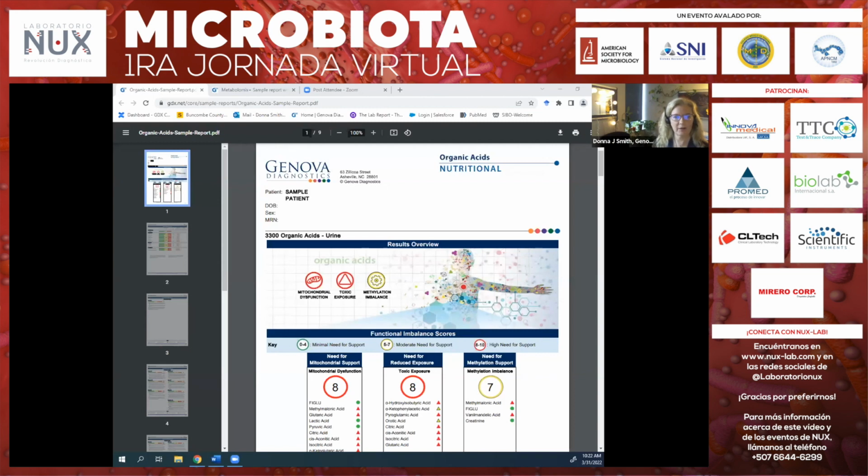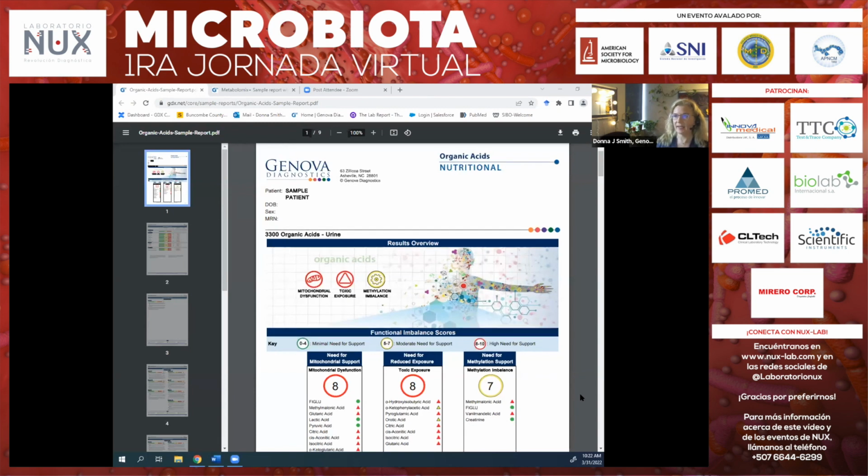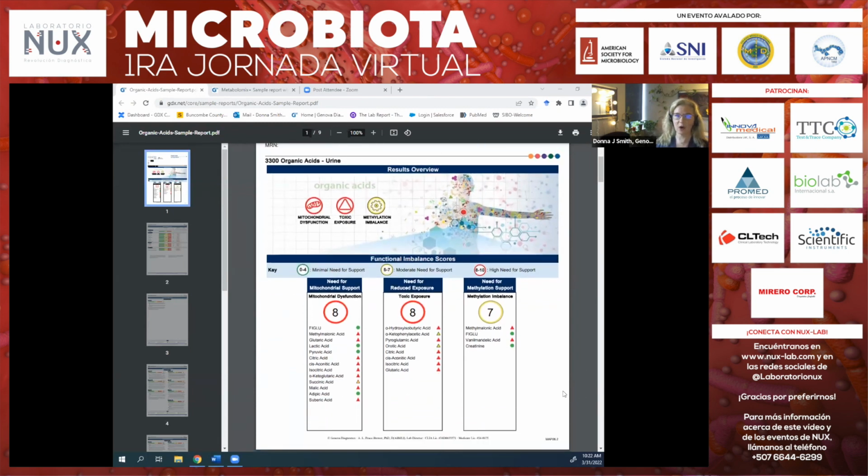So here on the first page of the organic acids report, we have a broad overview of functional imbalances in need of nutritional support. And here we have three broad categories: the assessment of mitochondrial dysfunction, the assessment for toxic exposure, as well as looking at the need for methylation support.